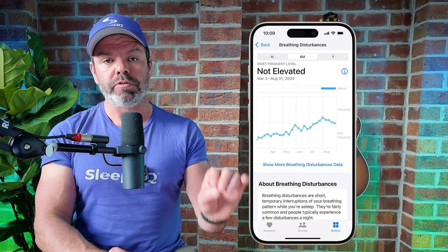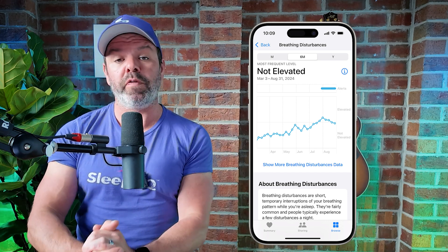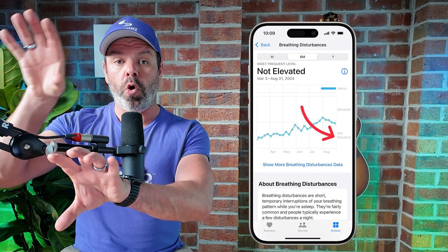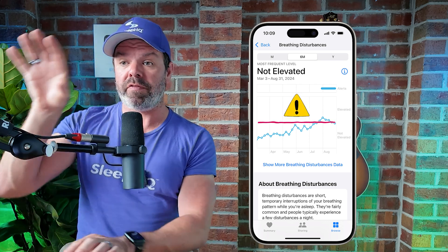Click Continue at the bottom and that's pretty much it. Once you've completed the setup, all you need to do is wear your watch to bed, and in the morning you can view all your breathing disturbances and sleep apnea notifications. You can find them again in the Respiratory category inside Apple Health. Apple categorizes breathing disturbances as either 'Not Elevated' or 'Elevated.' If you're in the elevated category for a long time, you can download a PDF and take that to your specialist or doctor to discuss a proper sleep test — this is just a screen, not a proper diagnostic test.